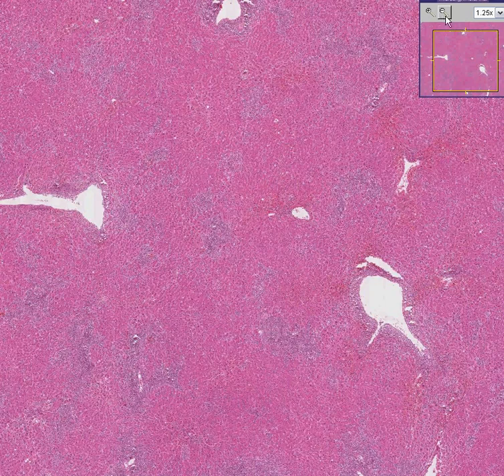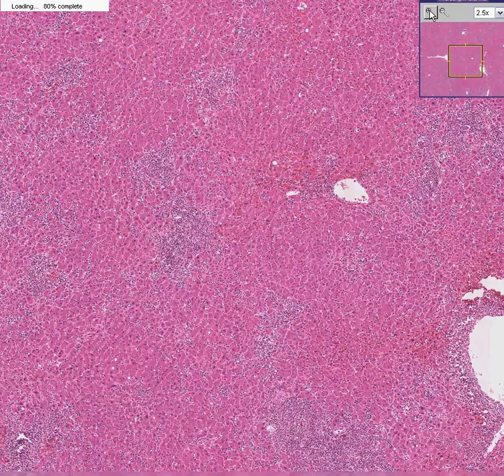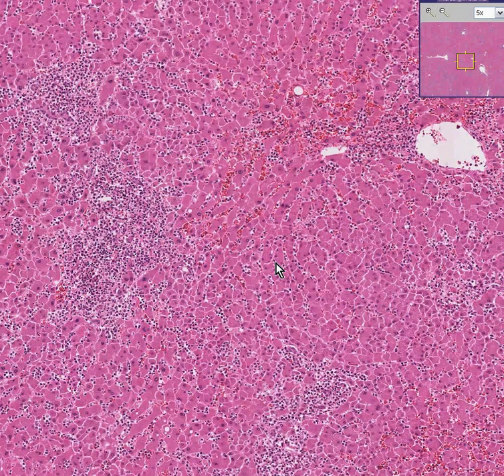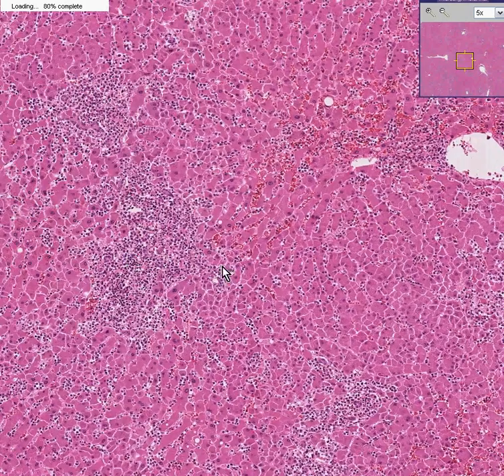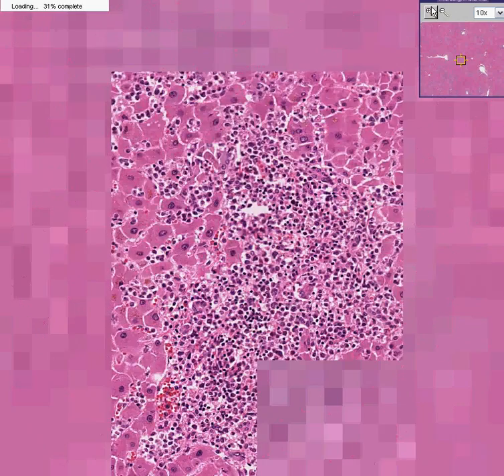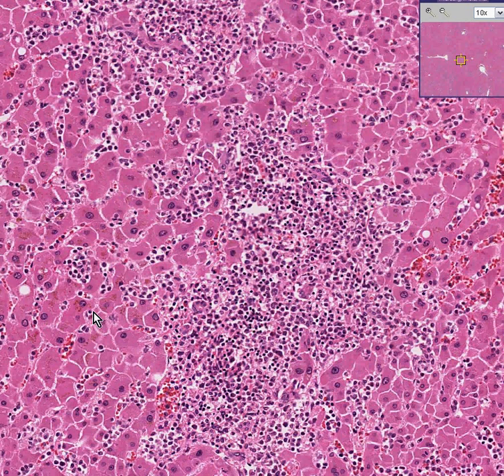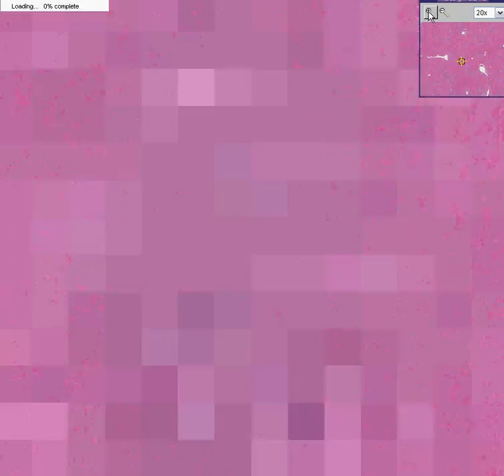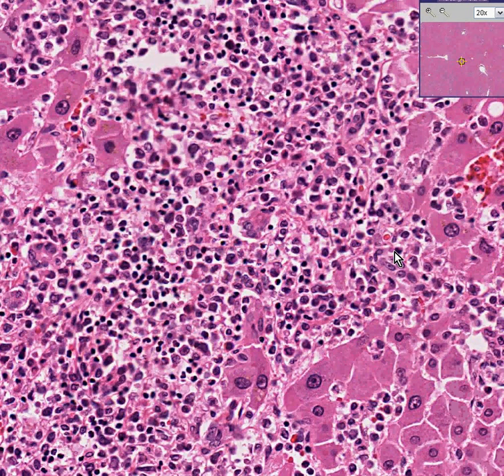Here is a liver — you can see that instantly, and if not I'll be glad to show you some nice cords and sinuses. Notice that dispersed throughout the parenchyma, throughout the sinuses and perhaps central vein areas, you can see these infiltrates all over the place. Although we see a rather normal appearance to the hepatocytes, about a third — maybe a fourth or fifth — of the liver is involved with these cells, diffusely infiltrating like a malignancy.